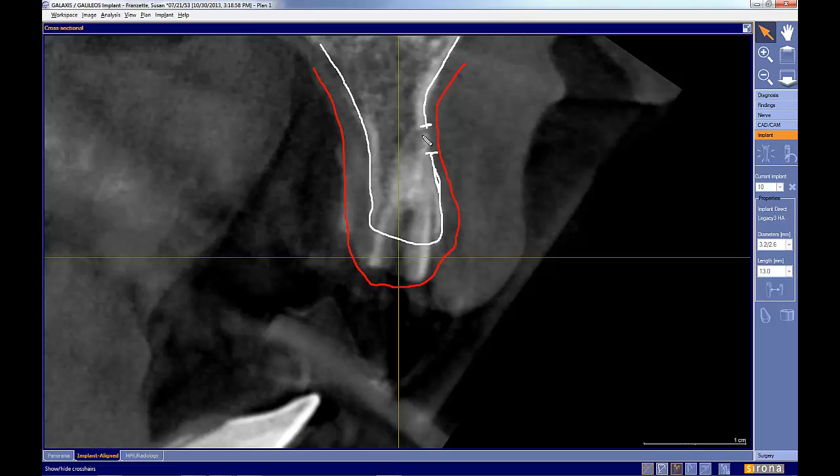I'm going to get some graft material here to create some thickness, because we know the trauma of extraction, curetting out the area, placing the implant, there's a good risk that we may perforate that plate just from the thinness or from the trauma of the surgery, from the wound healing. So I want to get some bone in here to add some thickness to protect my implant and prevent that. Or if there's a dehiscence, which there's a good chance there may be here, then I know I need to raise my flap to at least right up in this area, and then be able to graft a little bit of bone here. Five years ago I would have said that sounds crazy. Today I would say that's pretty routine, no big deal.